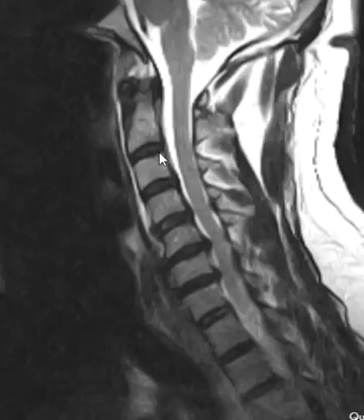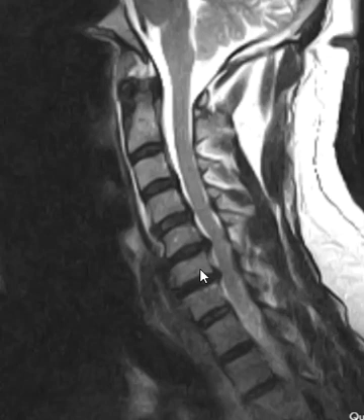This is the neck. You can see these little squares of the cervical spine, and down here we see this little black line, another black line. These are the intervertebral discs. These are the shock absorbers or the cushions between the bones. And we can see that the disc is poking out backwards here. This is the front of the neck. Here's the back of the neck. And there's a disc herniation poking out the back.